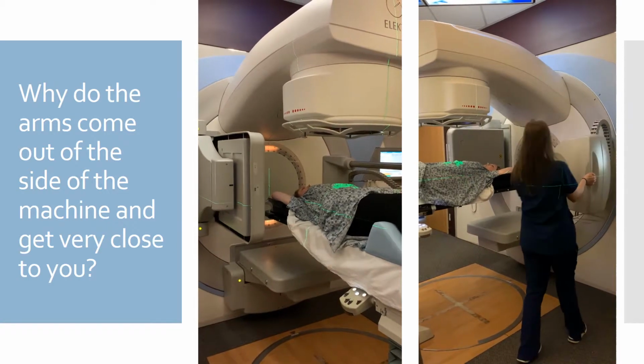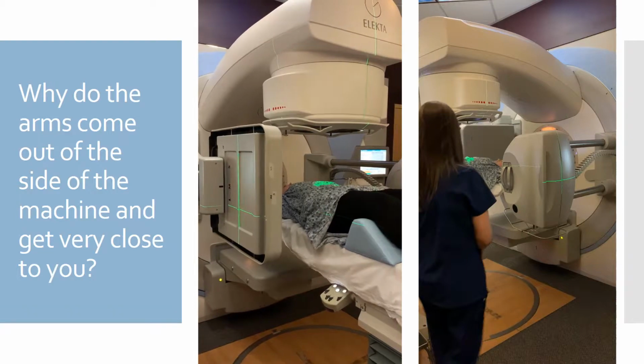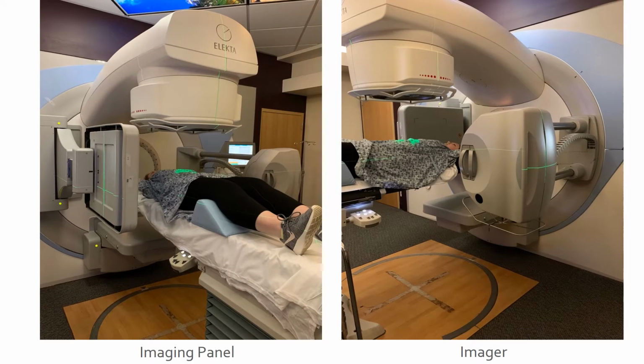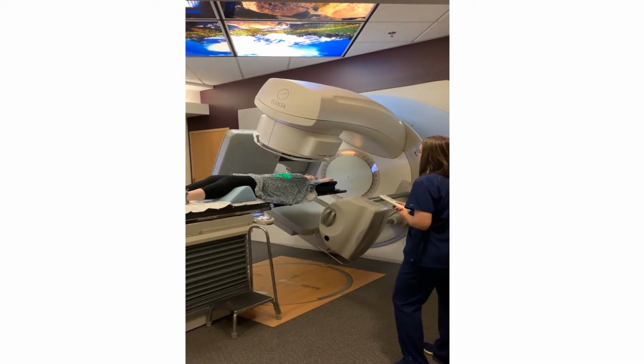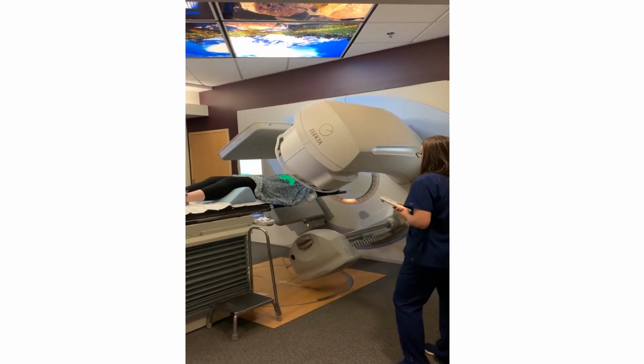There are two arms that will extend out of the machine. One is the imager, which is used to take the image, and the other is the imaging panel, which captures the image information. The machine will rotate around you as the image is being taken. Although it might come close to you, the imaging equipment will never touch you.